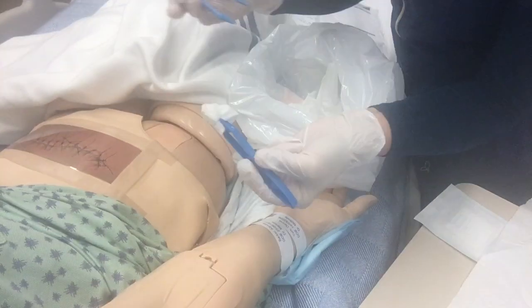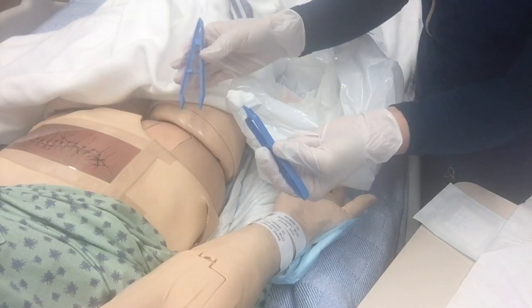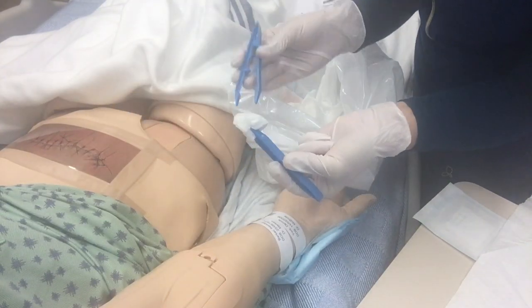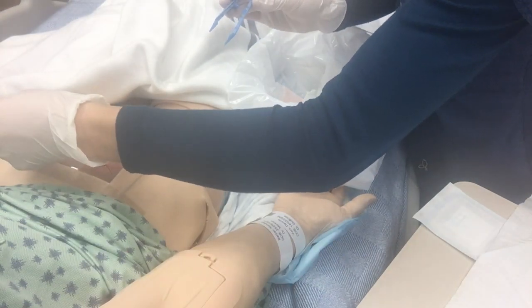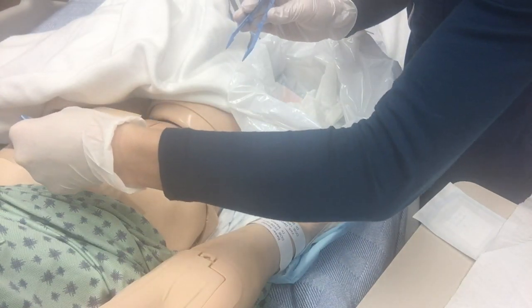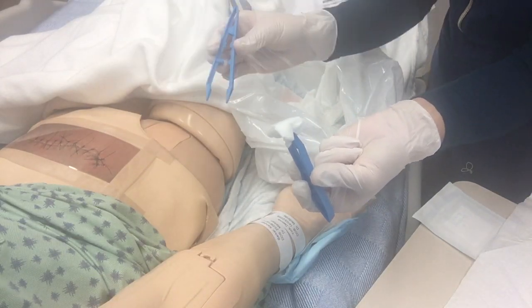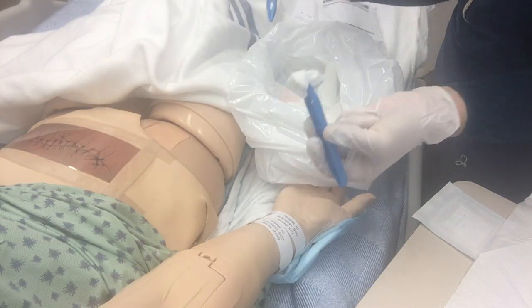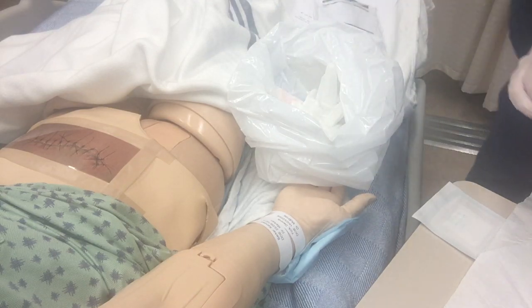On the wound, I'm going to be cleaning it from area of cleanest to dirtiest, also noting where the gravity is going to be taking the water, the saline. And I'm going to be doing one swipe per swab. And as I go over, I'm just going to check the bottom of this, to see what kind of exudate or anything is coming off or sloughing off, and then just drop it into the garbage.